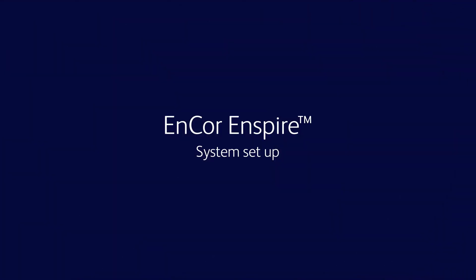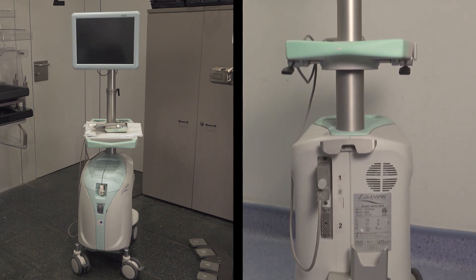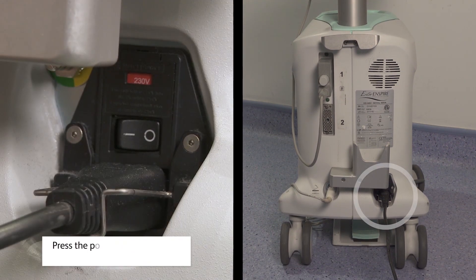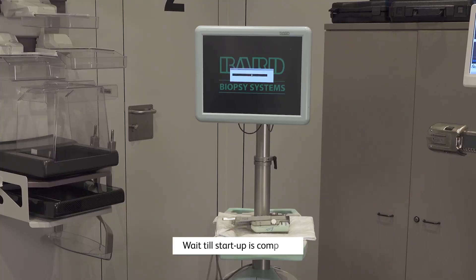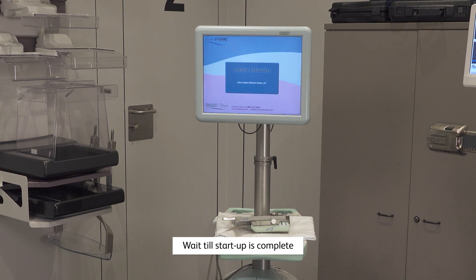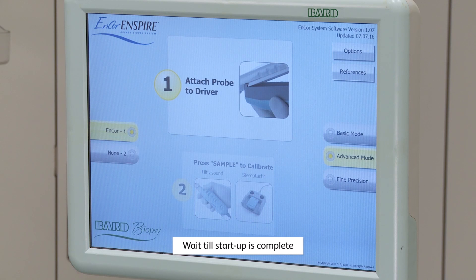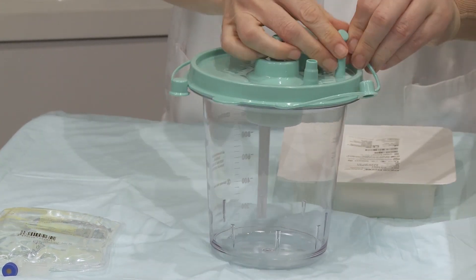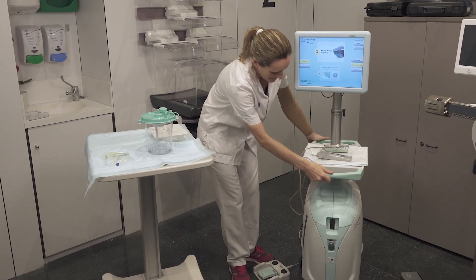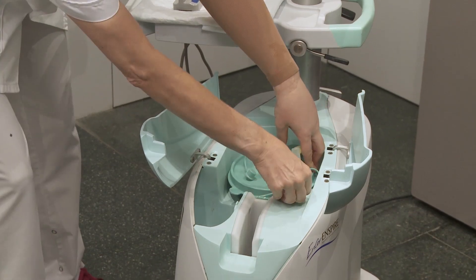Get Encore Inspire ready for biopsy. Before attaching the probe to the driver, let's put all accessories in place. Secure lid onto the canister. Secure large cap and tandem cap to lid of the canister. Place the canister into the console. Connect the yellow tube to the centre of the canister lid.